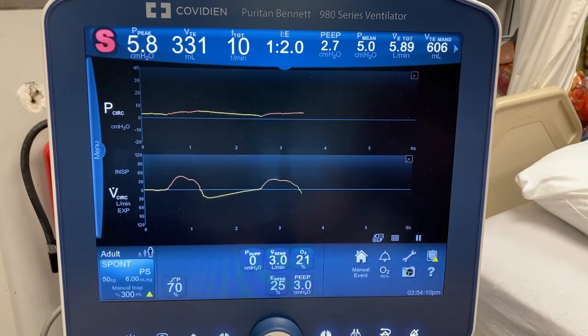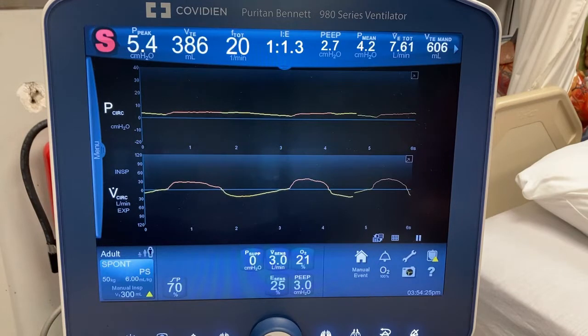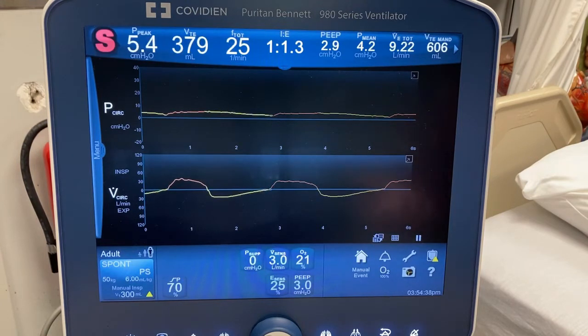Now, in what to tell people, just like on the other parameters, I always think it's important to let people know when the ventilator is going to feel a little different. So I just say, hey, we're going to do some breathing tests on you. Going to let you do a little more breathing on your own. It's going to feel pretty much like it does right now, but you'll be doing a little bit more work. We're just going to get some numbers, see if we can work on getting that tube out. That's what I do. Everybody has their own style.